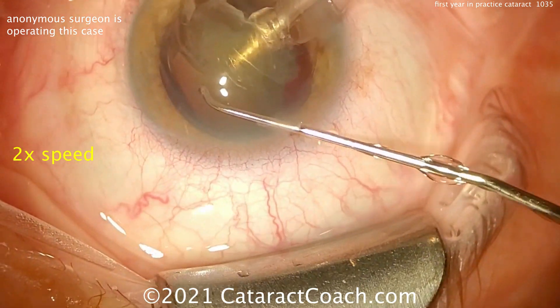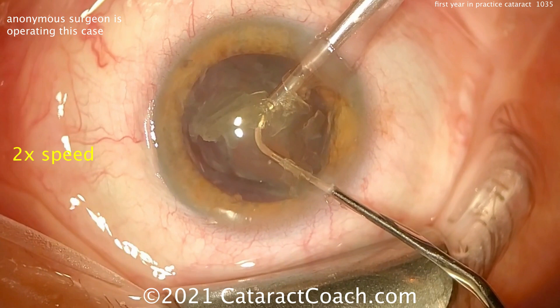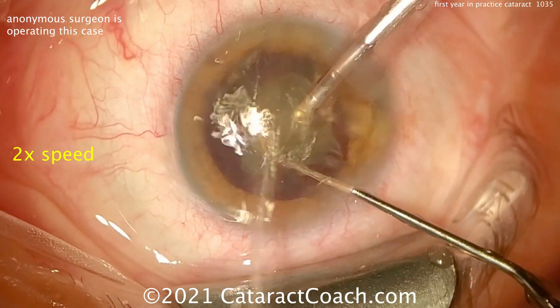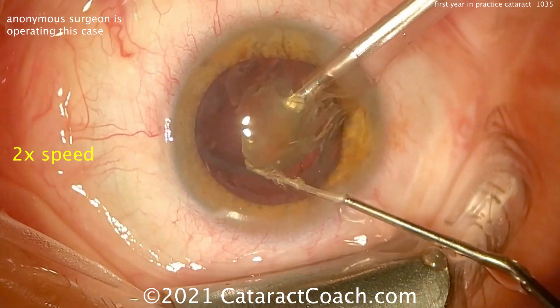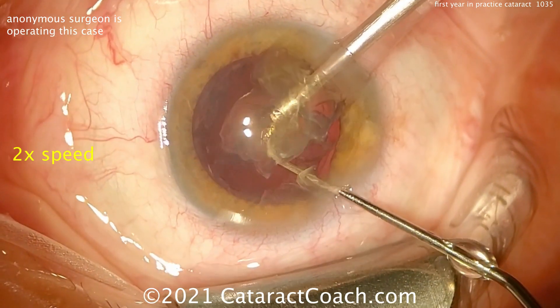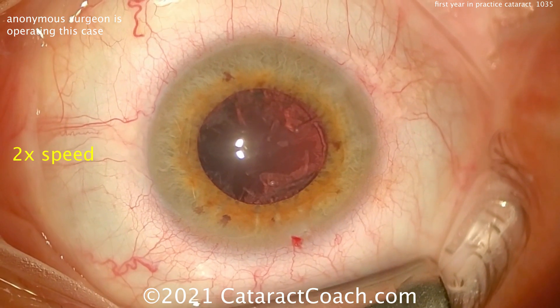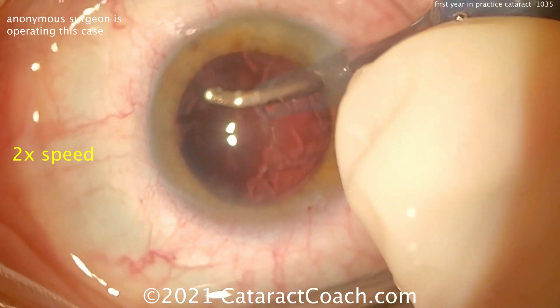I would like to have seen a nice full chop. There's the remaining nucleus, chopper going around. Hopefully we're operating at the iris plane and not too close to the corneal endothelium — that looks pretty good. This is a lens with a very moderate degree of nuclear density, not too dense at all, relatively soft. The mark for me is not speed of the surgery — it's how much control the surgeon has, and you can see that especially during nucleus removal. This is pretty good control, but I'd like to see next time a better chop right off the bat. Use a chopper without that bulbous tip.